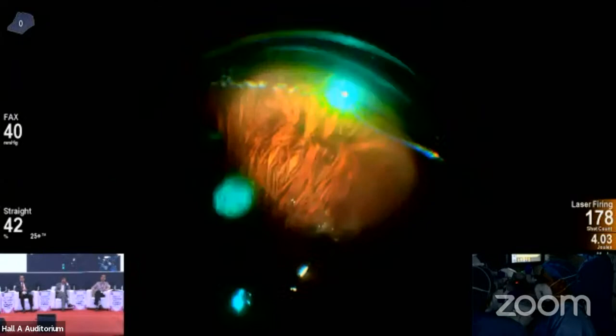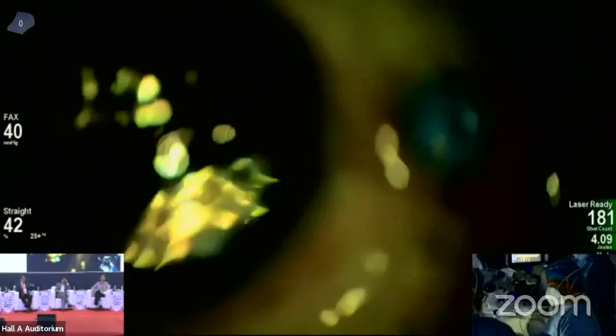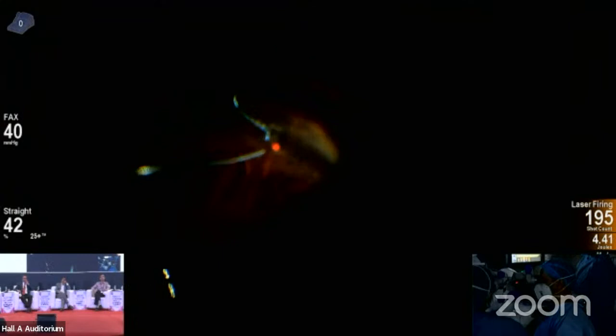Okay. So we've done the temporal side. Now we'll go to the nasal side. So we'll have to change the hands. So this is a pseudophakic patient, but in phakic patients, sometimes it may be a little problematic to laser the periphery. So in those cases, these curved laser probes are really useful.